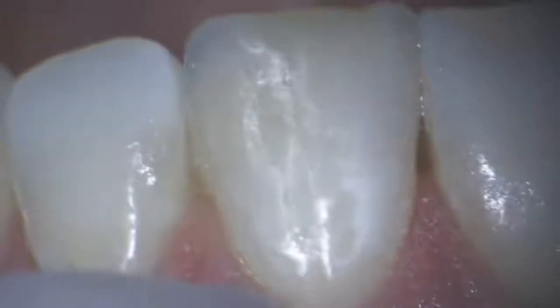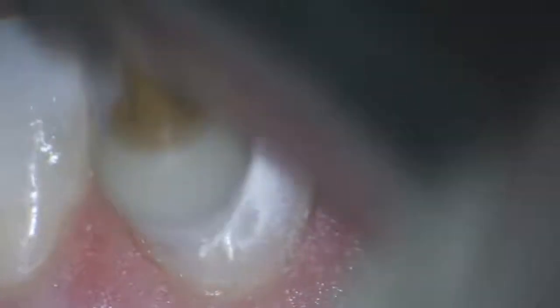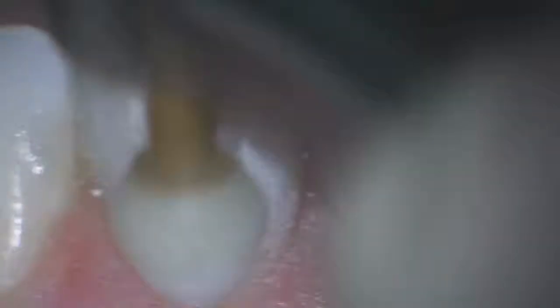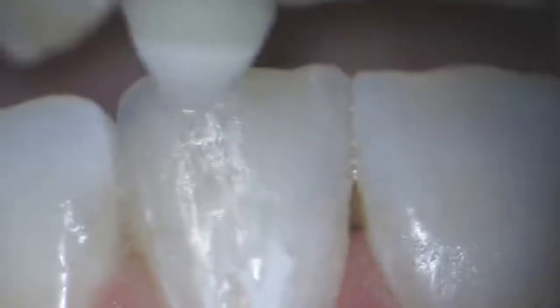So the next stage after final polymerization of the composite was anatomical contouring and grinding using different rotary instruments. The first tool with which I started the process of grinding was an Enhance tip in the shape of a cone. I really like Enhance tips from Dentsply Sirona because the abrasiveness of this kind of instrument is sufficient for reducing composite, but not enough to harm the enamel edges.